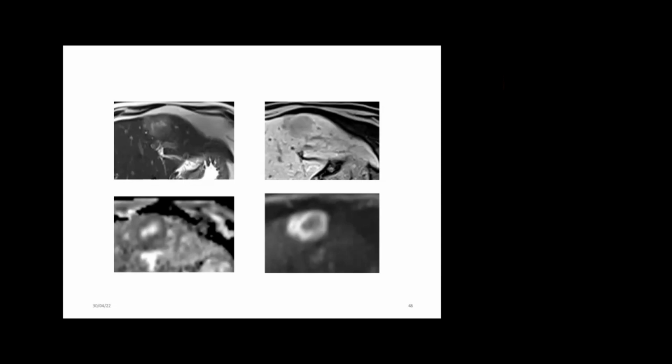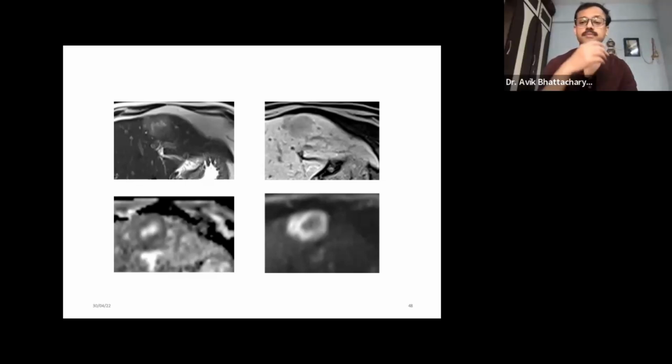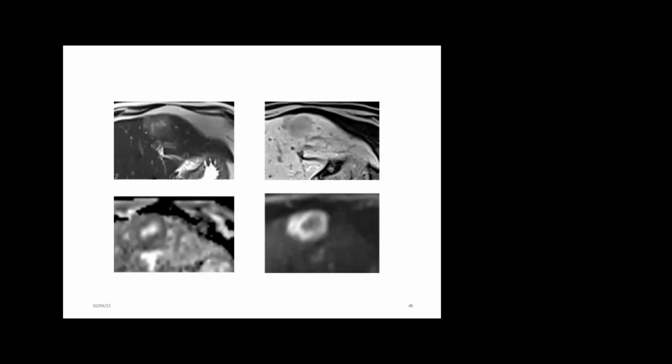Suppose they are given a plate in the examination, suppose a CT plate. So how could they describe a particular lesion? Suppose one lesion you have shown in the background of cirrhosis. So what should be a classic description? How should they describe a classic lesion in the liver?